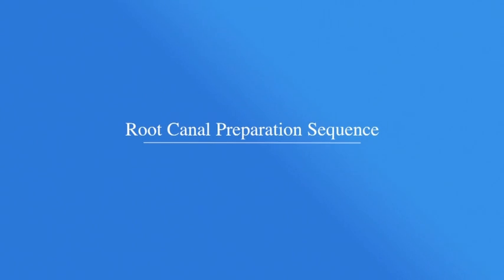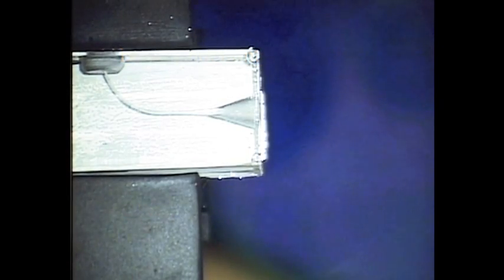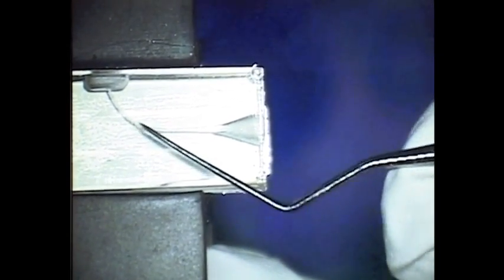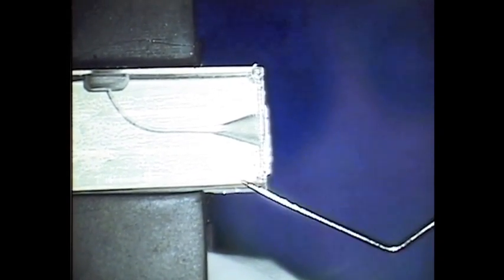I'm now going to do a demonstration on root canal preparation in a crowned down approach using Gates Gliddens and Flexo files, which are made from stainless steel. You can see here we've got a simulated root canal in an endo view block, and this hasn't been prepared as yet.